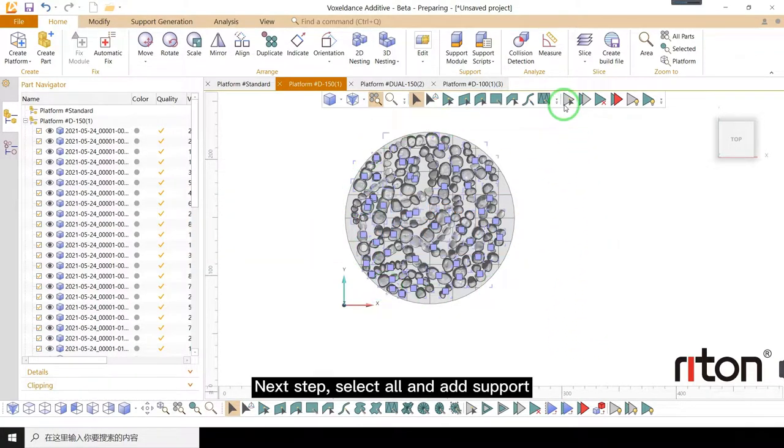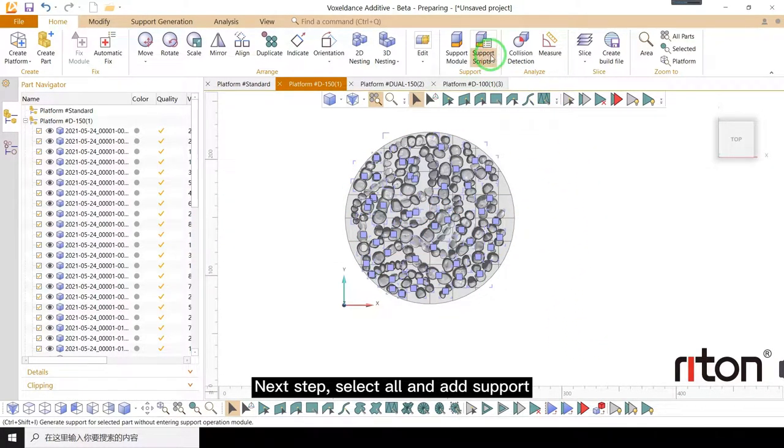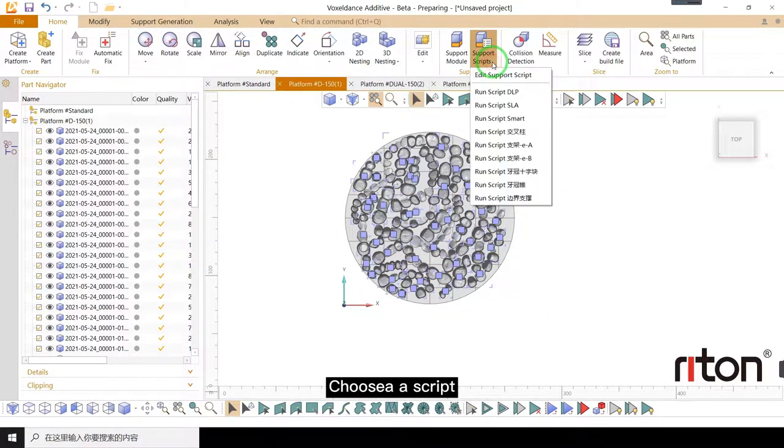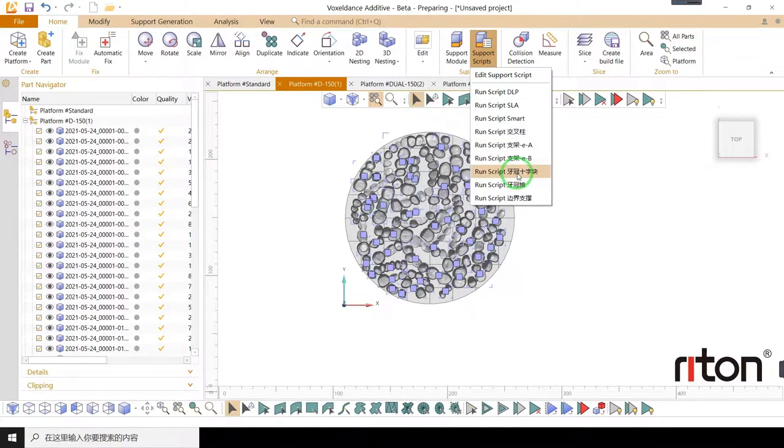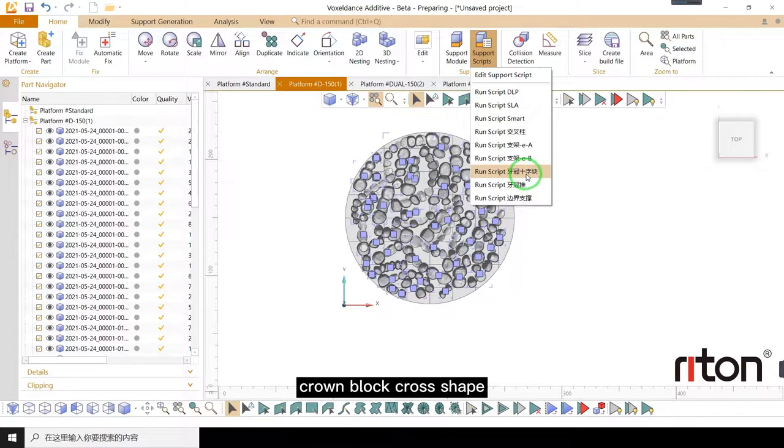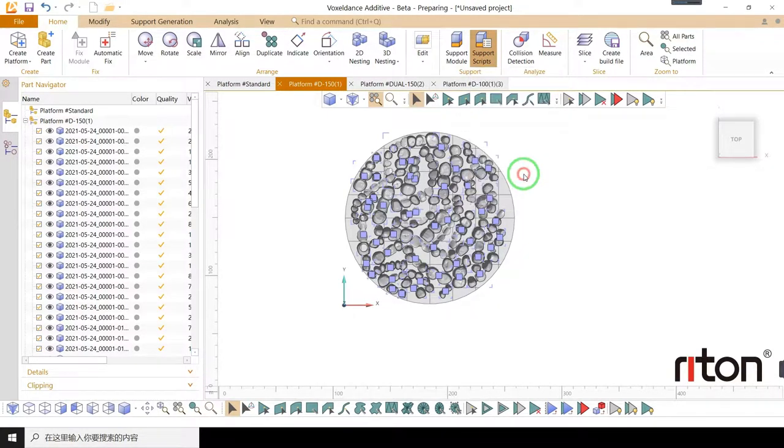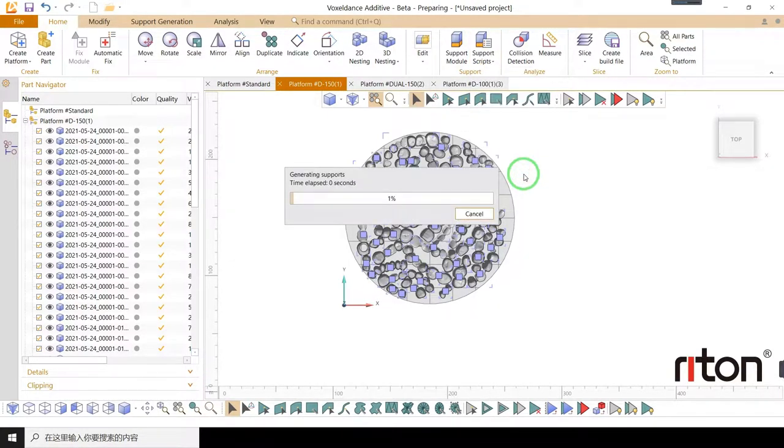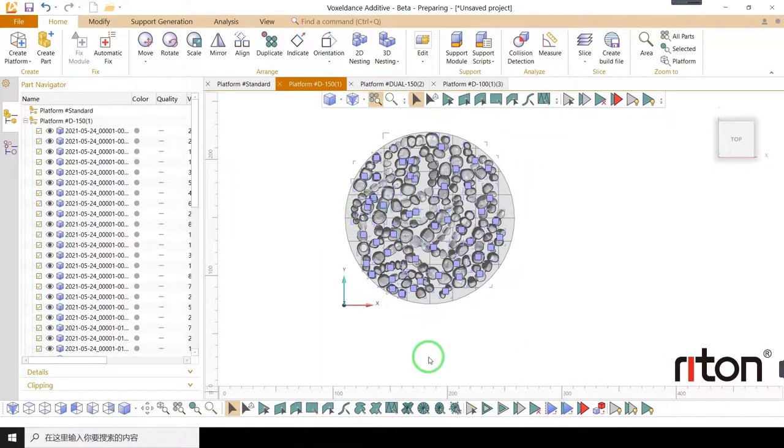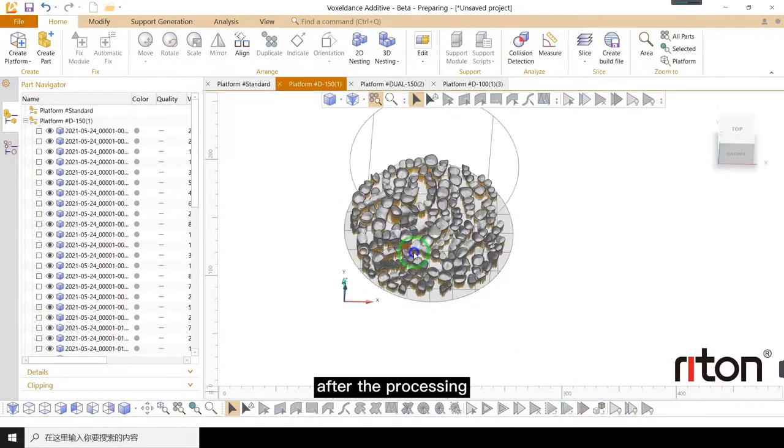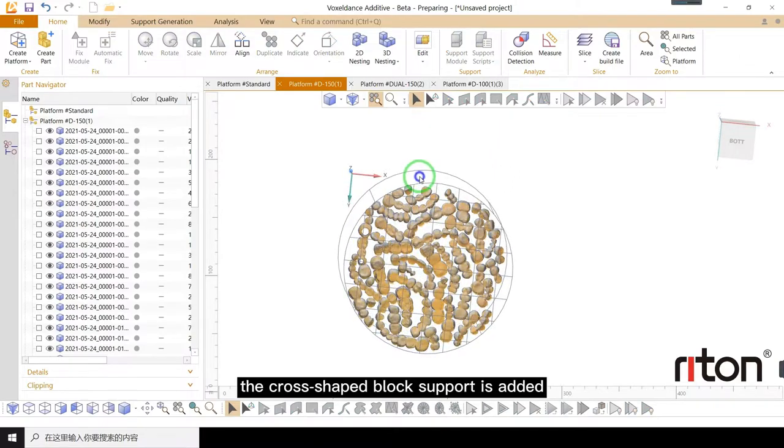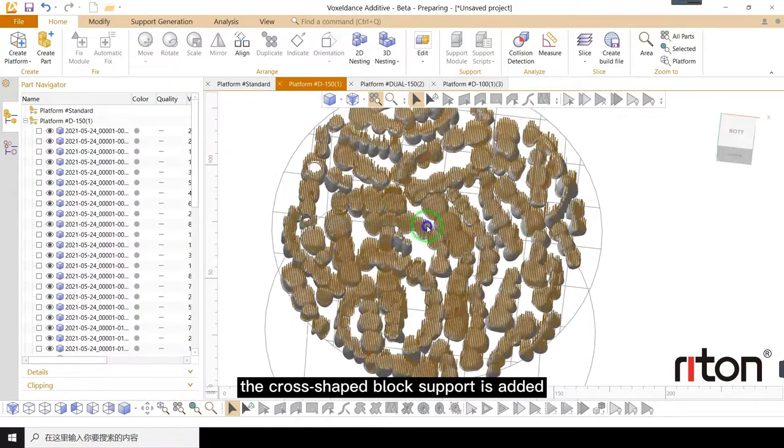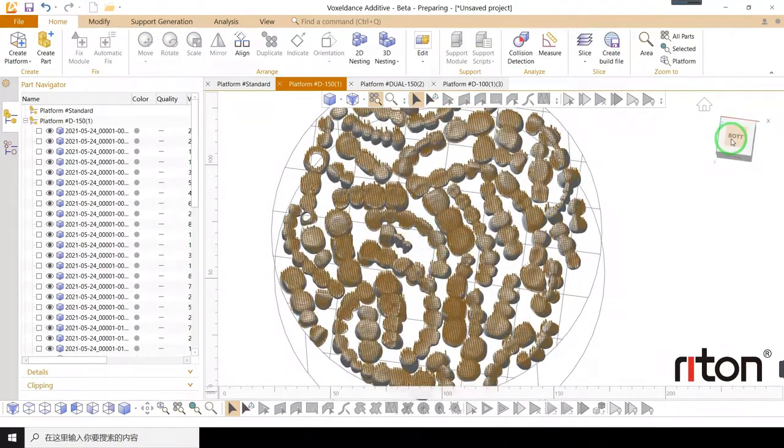Next step, select all and add support. Choose a script: crown block cross shape. After the processing, the cross shaped block support is added.